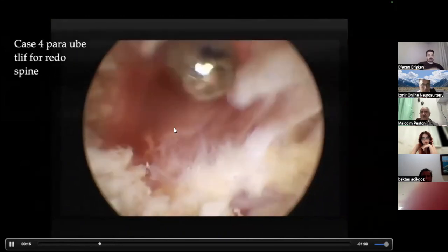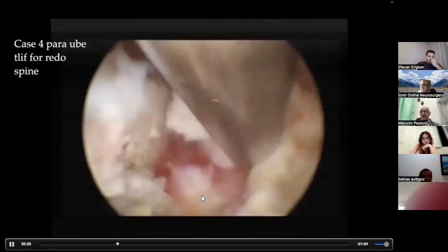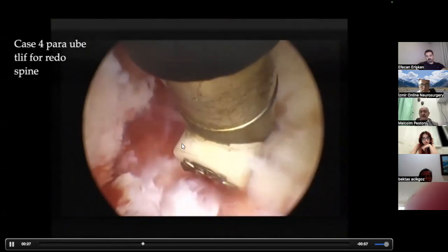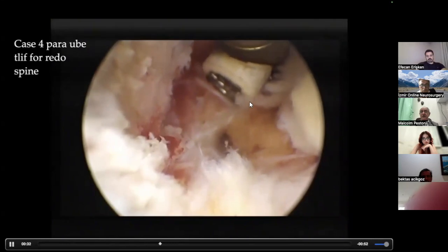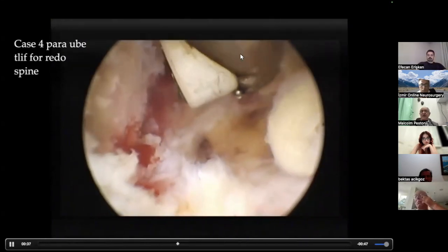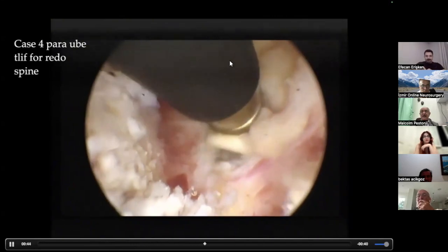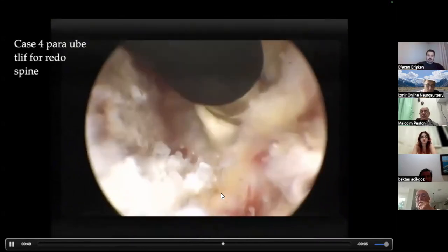But below the SAP, you can see how these veins are plastering this whole nerve root to the discal surface. I have to be very careful in my mobilization of this fragment, otherwise I can easily tear the nerve root. Now, as I go down in the axilla, I can see this vein. Can you see this vein? 1, 2, and 3. Beautiful, you can see the 3 veins. I have to just keep on pushing from here. I know that my nerve roots are safe. I can control my bleeders. I know where my nerve root lies, and I can easily then create the zone for a fusion.